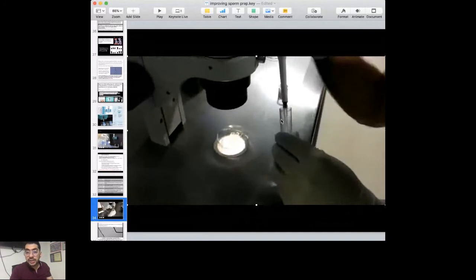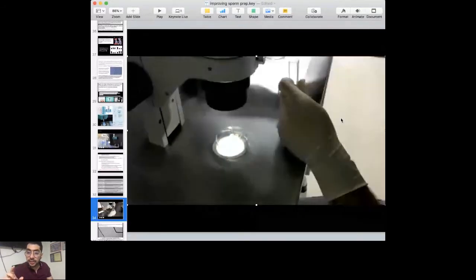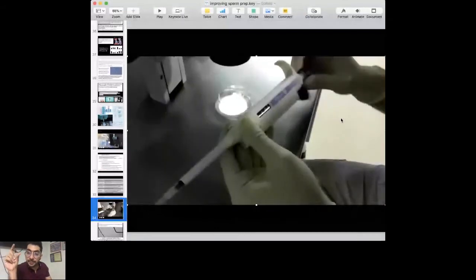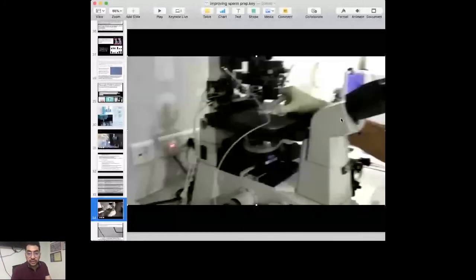Now, this is for the smaller chambers where you're using only a very small amount of sperm sample for separation. There are newer devices available where you load the sample over a membrane, and you can load almost 2 ml to 3 ml of sample over that membrane, and the sperms just pass through it, and you can use this for IUI. But if you want to use a microfluidic device for IUI, it costs anywhere between 10 to 15,000, so your cost for IUI dramatically increases. So this is what I was talking about.